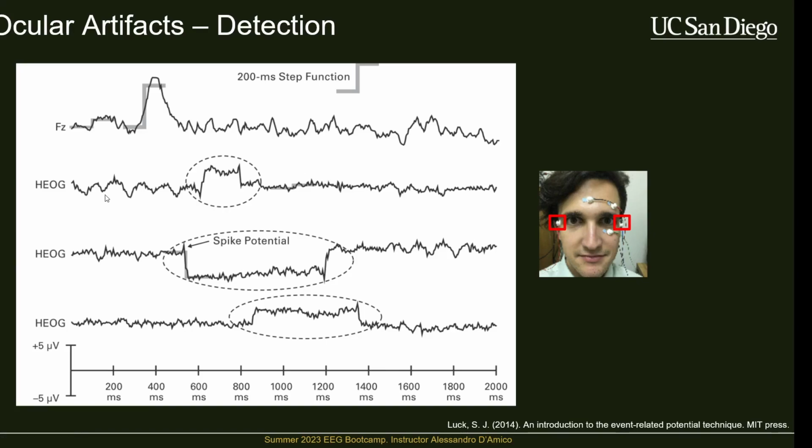Rather than being at the same thing, because you don't usually record multiple, like you wouldn't record 3 sets of HEOGs. But the thing to keep in mind here is this stereotypical type of pattern, which is this step-like function. Whenever somebody moves, like if you're looking straight ahead and you move your eyes to the left or to the right, it's going to generate this massive spike that is sort of like a step, and it's going to level out there. And then when you move your eyes back, it's going to go back to the original DC offset that your signals were at.